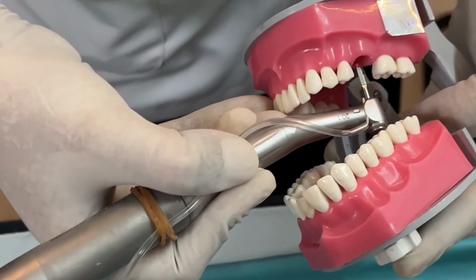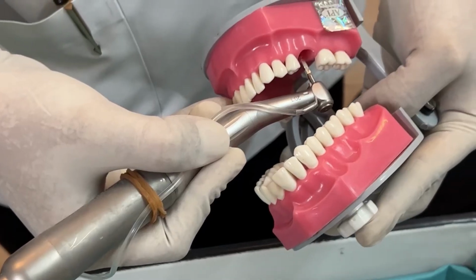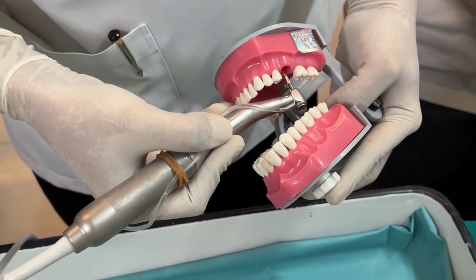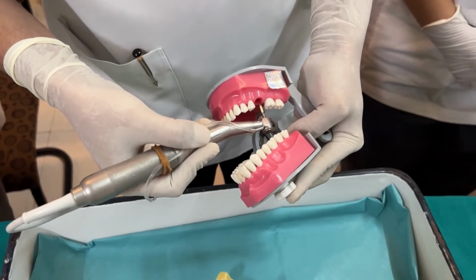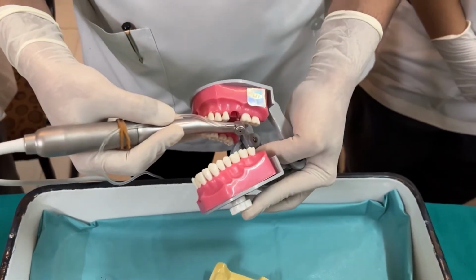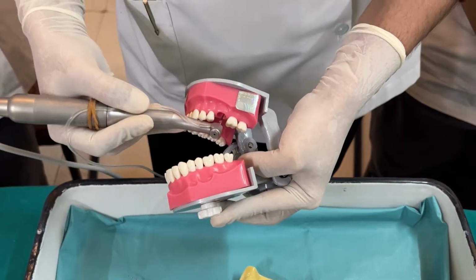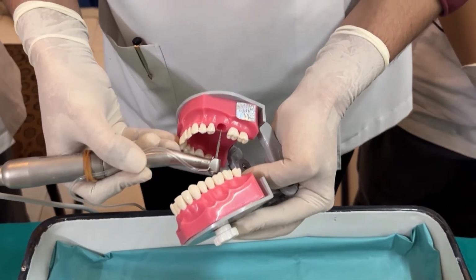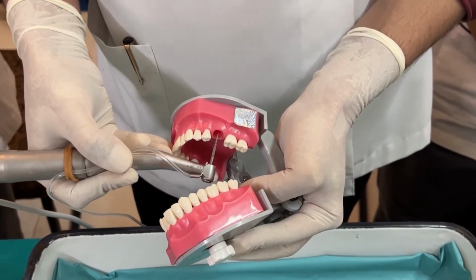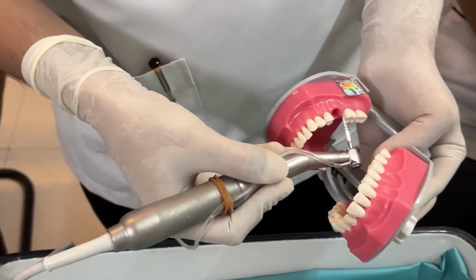So if you were to do this sort of osteotomy, keeping the future tooth in mind, the longevity of the implant would be quite a bit. If you were to do an osteotomy like this, ultimately the forces won't be directed along the long axis of the implant, and if you were to do an osteotomy like this, again the chances of failure of the implant are quite a bit. So is it fine?